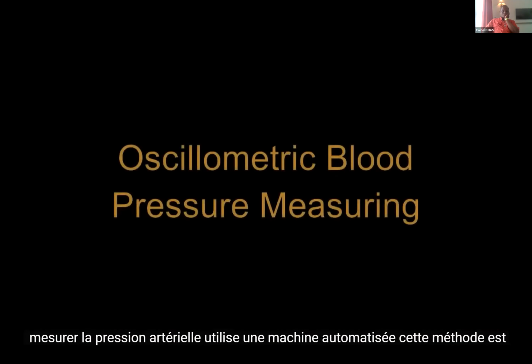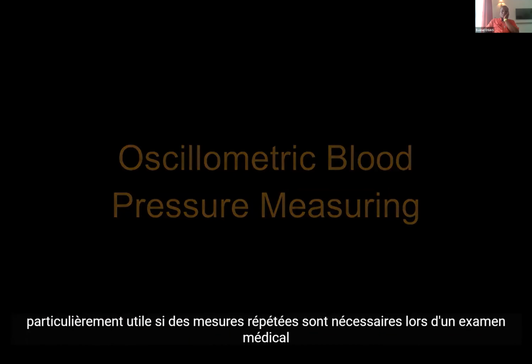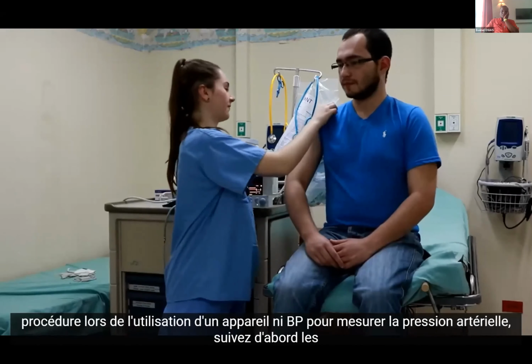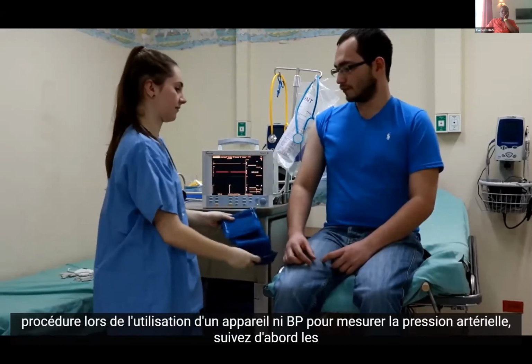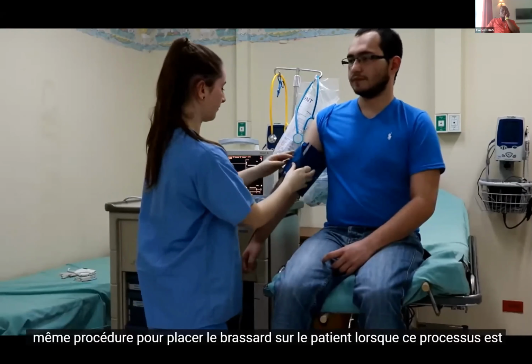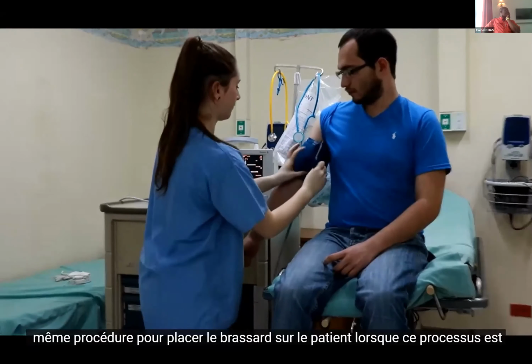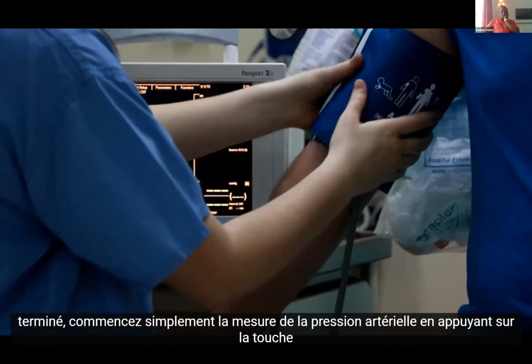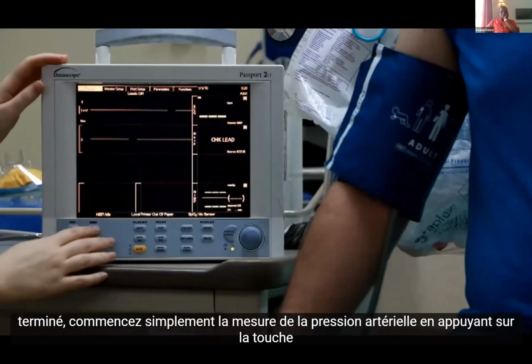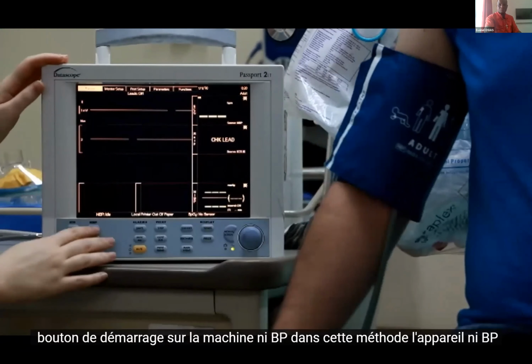The other method for measuring blood pressure uses an automated machine. This method is especially useful if repeated measurements are needed during a medical procedure. When using an NIBP device to measure blood pressure, first follow the same procedure for placing the cuff on the patient. When this process is completed, simply start the blood pressure measurement by pressing the start button on the NIBP machine.